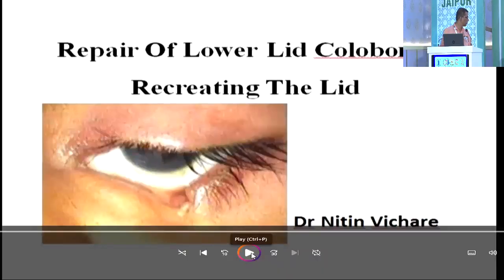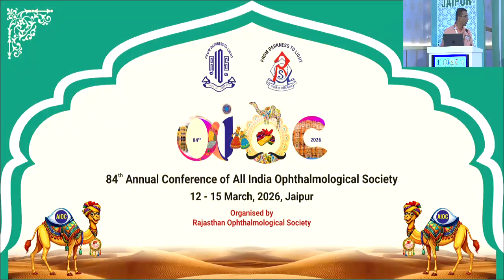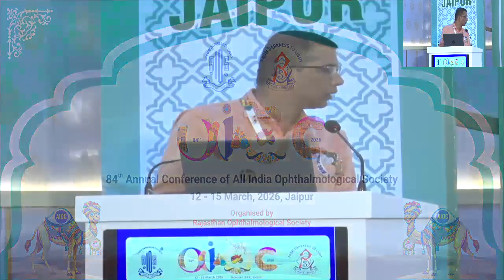Thank you for the nice presentation. How do you assess the length of the relaxing incision on the temporal side? How much length should it be?